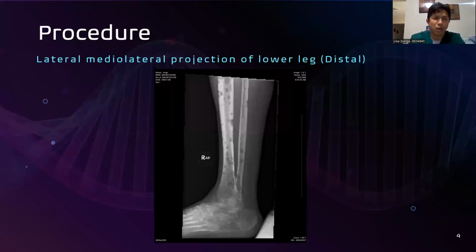To start, I'm going to explain the procedures that we took for positioning, and then we're going to talk about what we see on the X-ray, because as you can clearly see, there is something going on in these X-rays. And now we're going to also address the other evident pathology in the patient. This positioning was challenging because the patient could not move.